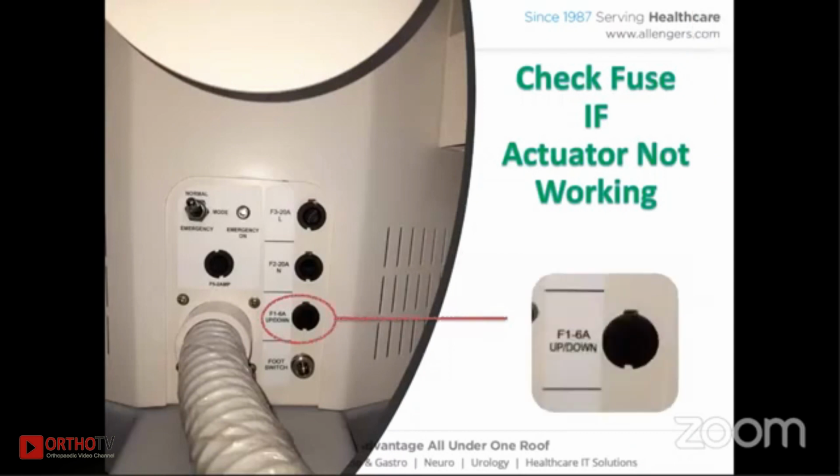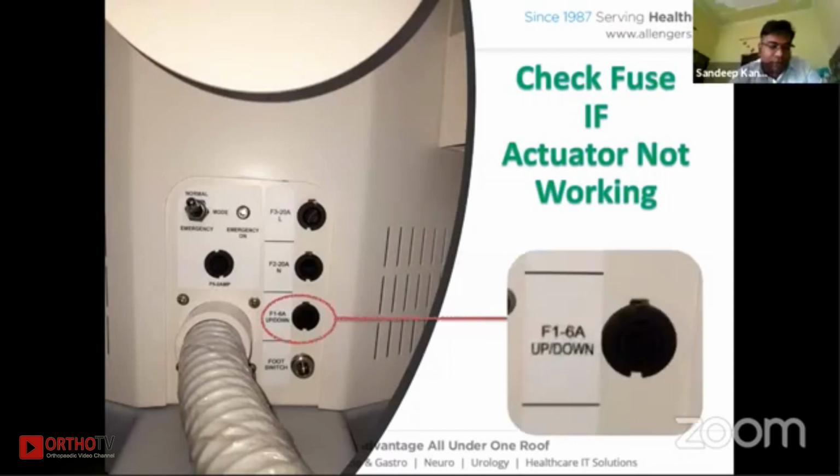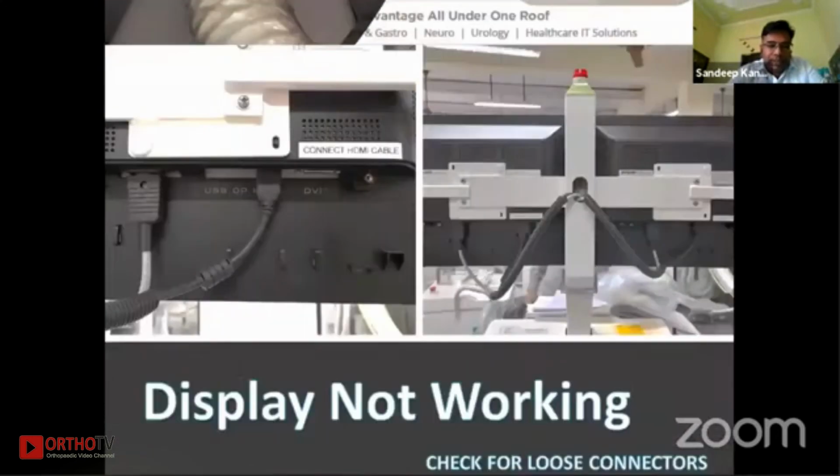At least you can complete your surgeries that way, sir. After that, sir, there are a few problems noticed where the tube's vertical movement is stuck. In the machine there is one fuse, clearly marked up and down. It is about 6 ampere. If you face that initially, you can check it at that time, replace it and try to work it out, sir.